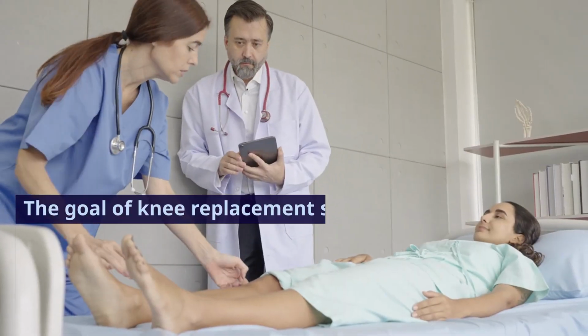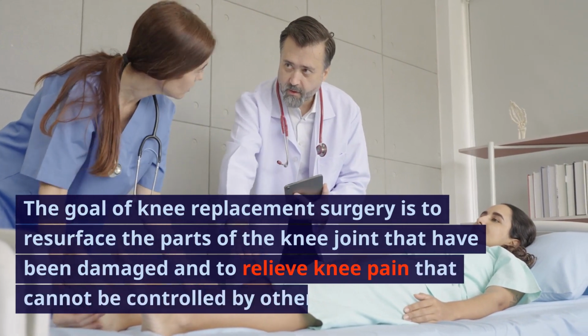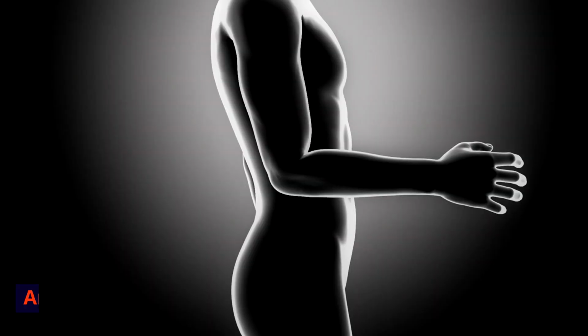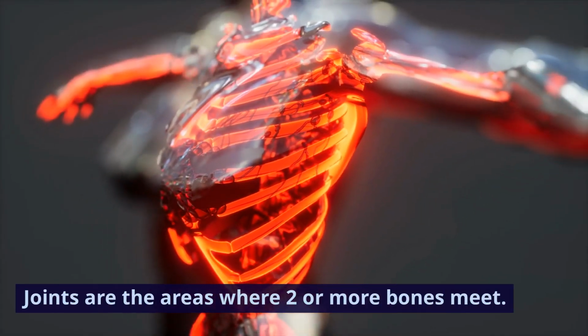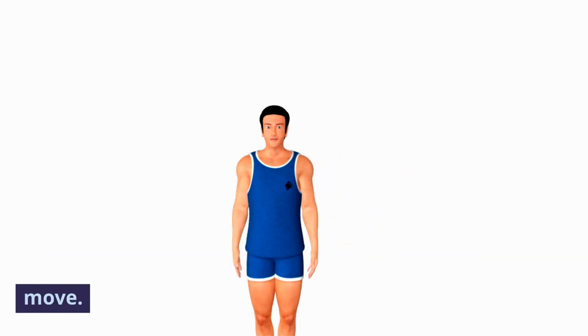The goal of knee replacement surgery is to resurface the parts of the knee joint that have been damaged and to relieve knee pain that cannot be controlled by other treatments. Anatomy of the knee. Joints are the areas where two or more bones meet. Most joints are mobile, allowing the bones to move.